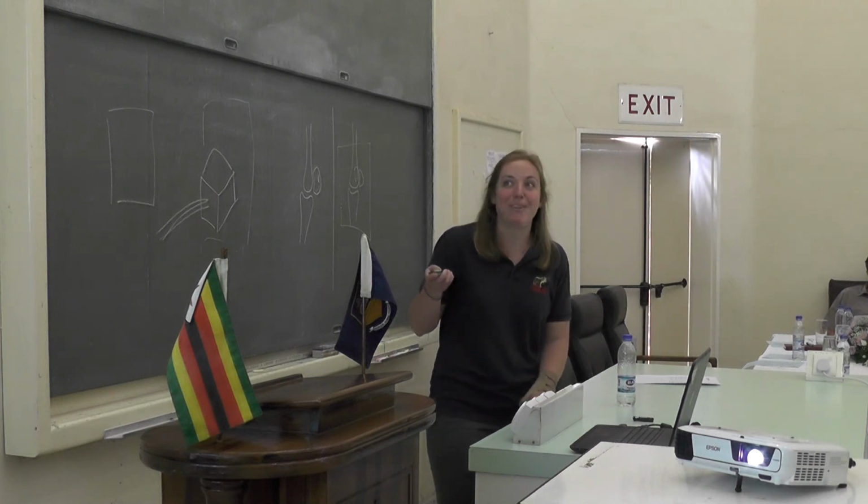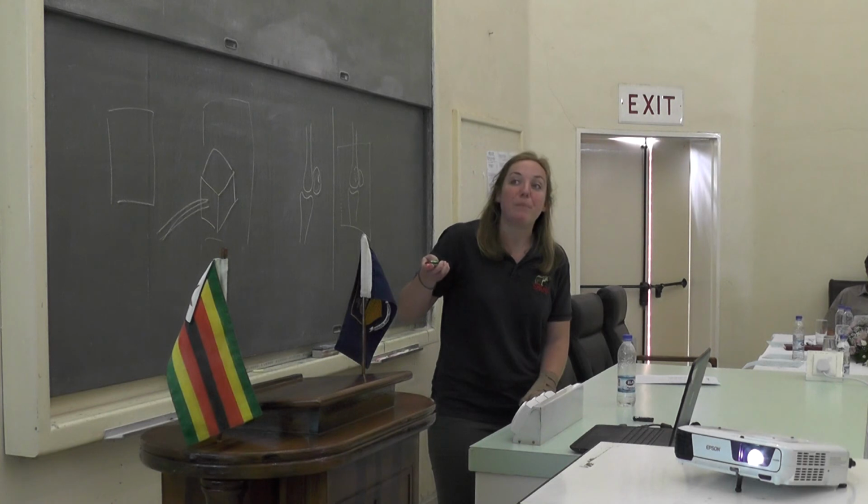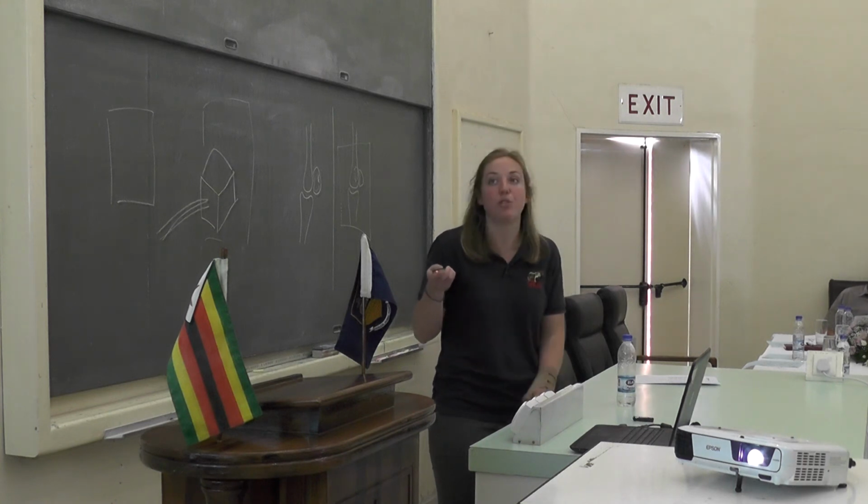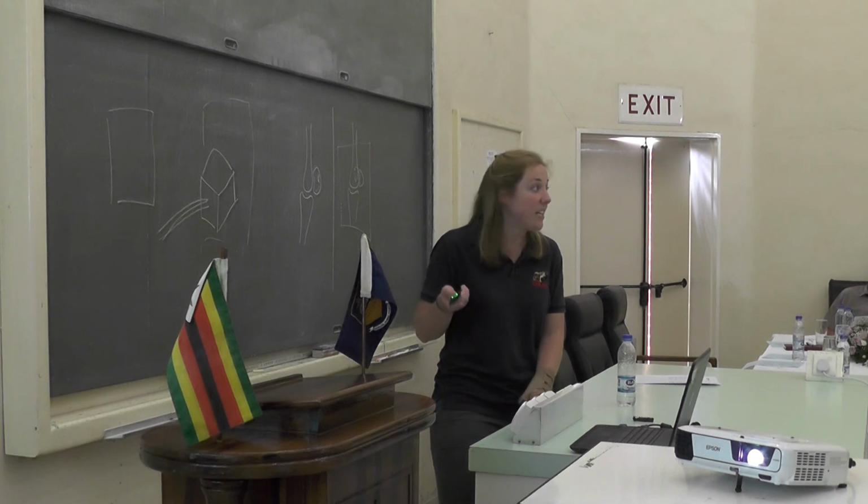However, in a donkey, if we're looking for laminitis, we would be overwhelmed by the apparent prevalence of the disease, because naturally the third phalanx sits much lower down in the hoof capsule. That's normally over a centimetre, about 12 to 16 millimetres below, and this is normal. This does not mean that it is sinking. So we need to know these little subtleties so that we don't go off diagnosing laminitis in every single donkey. And that's it, really.